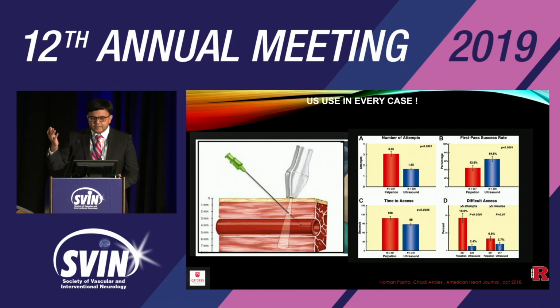And then Amir, for your case, we use ultrasound in every case. Again, cardiologists have done this study. Their time to access is much faster if you use ultrasound. Your number of attempts is less, and your artery doesn't go into spasm. So it's not just to measure the radial artery itself, but to decrease the pain to the patient and to avoid spasm. So we religiously use ultrasound. Once you get in the habit, it comes faster, like anything else.